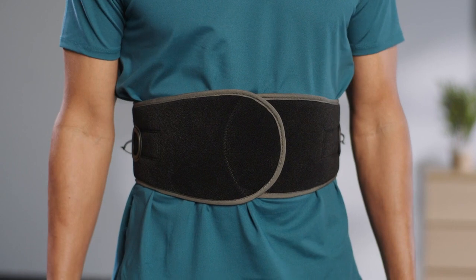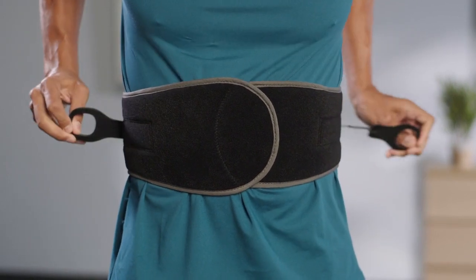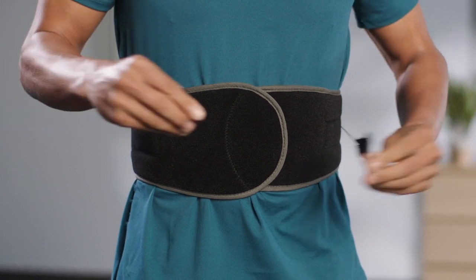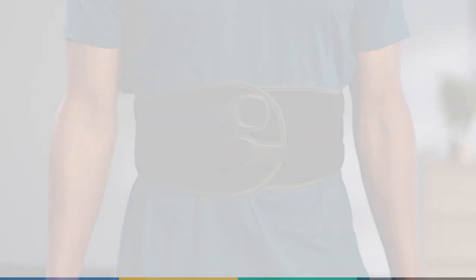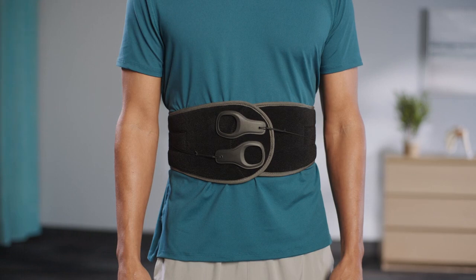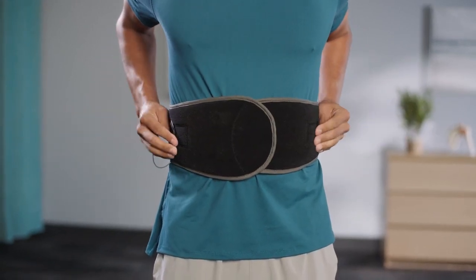Angle the brace up or down to accommodate the patient's anatomy. Adjust the tension of the brace by pulling the handles away from the body, then attach the pole handles towards the front of the belt. Detach the pole handles from the belt and position them closer to the back of the brace.